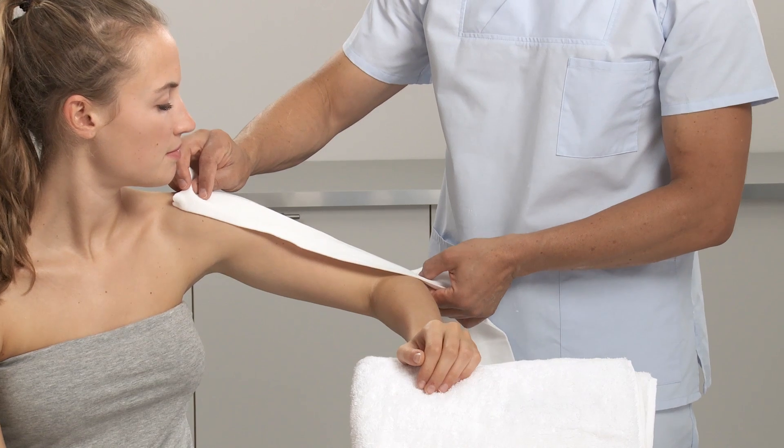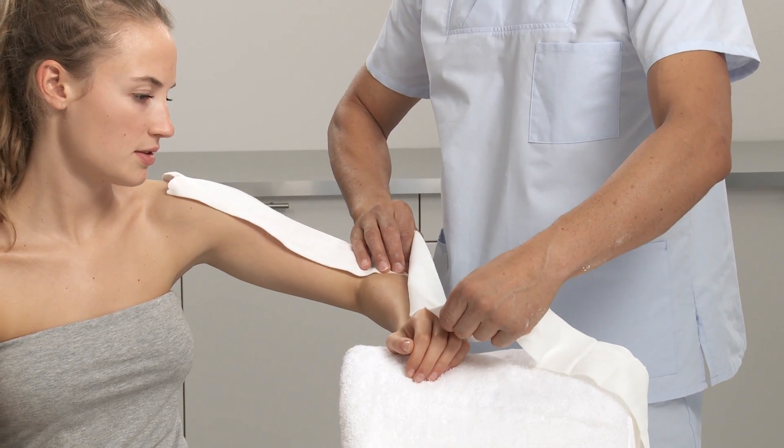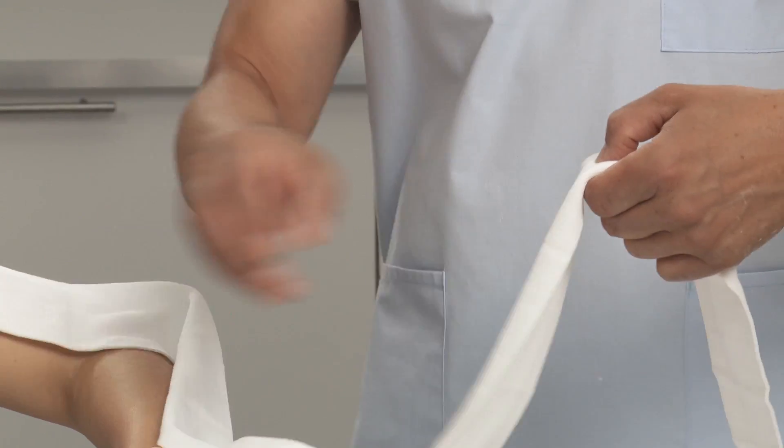Choose the appropriate width of stockinette for the arm. Measure the length of the whole arm from the shoulder to the knuckles. Add another 20 cm or 8 inches and cut.